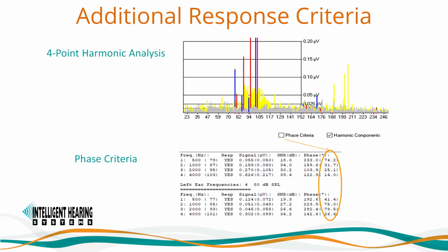When using iChirp stimuli, the amplitudes of the harmonics may be significantly higher. Enhanced signal amplitudes combined with harmonic information make the automated detection of steady-state responses easier and more robust, thus increasing the efficiency of ASSR testing.